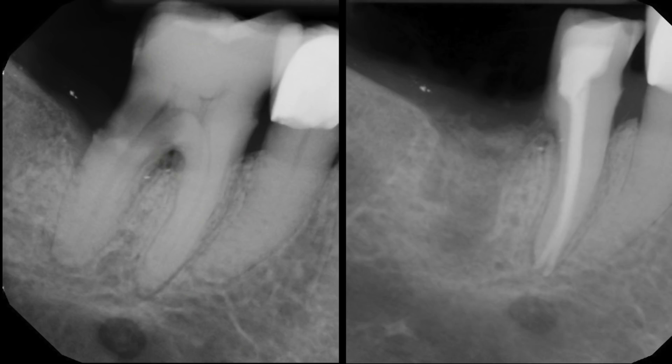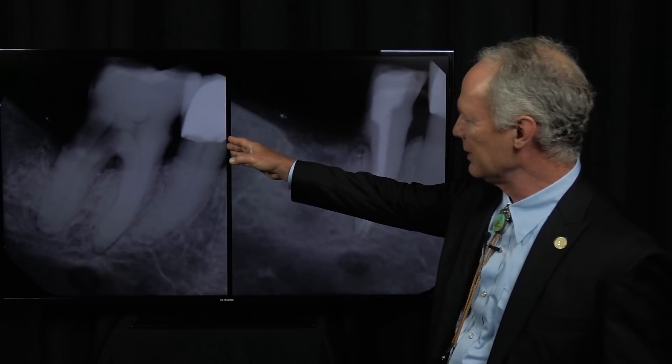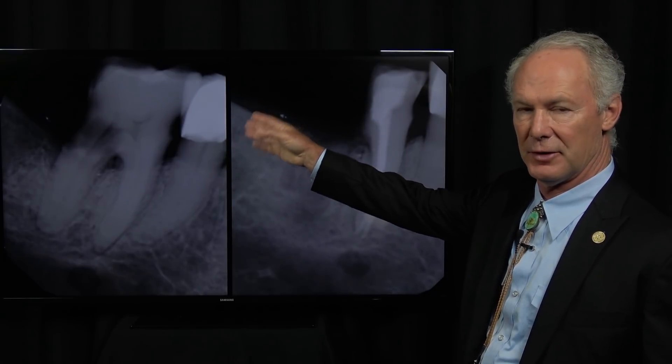Remember, we ought to have 10 millimeters of vertical bone from the inferior alveolar nerve to the alveolar crest so that we can place an 8-millimeter implant. And we didn't have that. So we wanted that tooth for chewing efficiency.